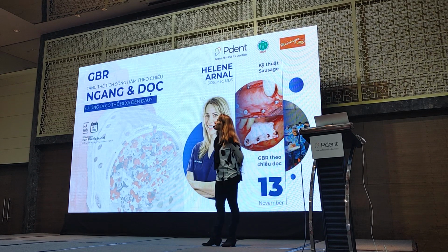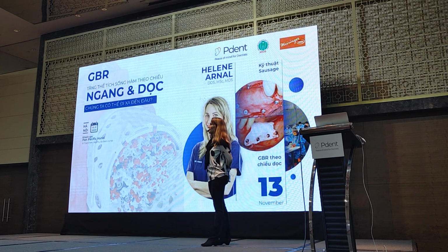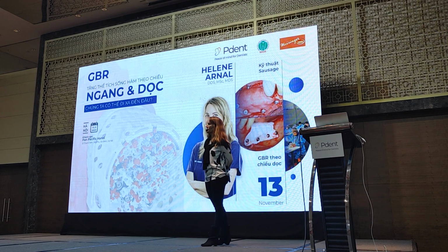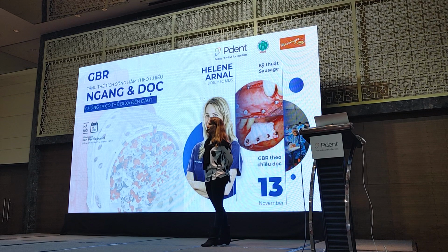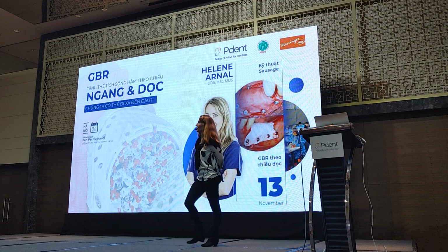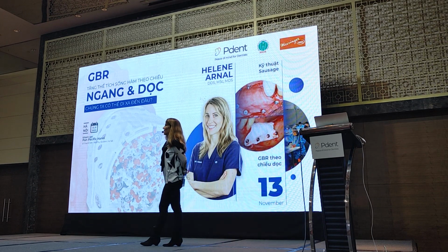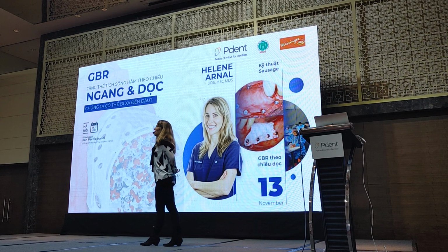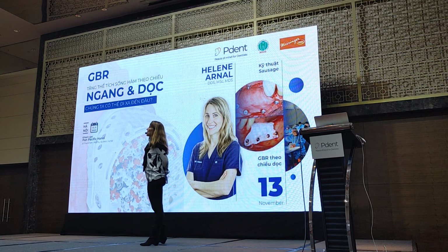You have a question: how to advance the flap if we have a scar and if the vestibular depth is very shallow? How to make the flap pass in case you have a scar or the vestibular depth is very shallow, if we have scar tissue.